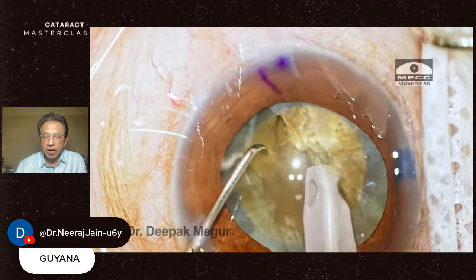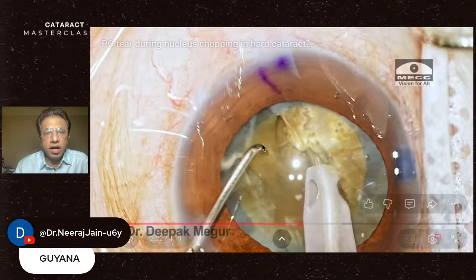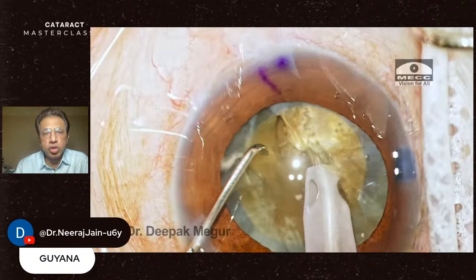So I would recommend, be cautious, decide what technique of nucleotomy you would want to use. My recommendation of late has been to go back and simply do the divide and conquer technique. Let me just show you that now.